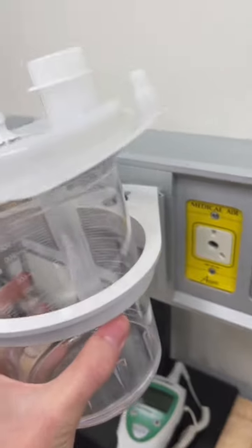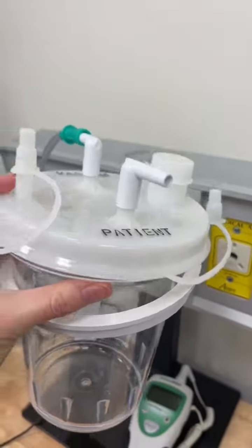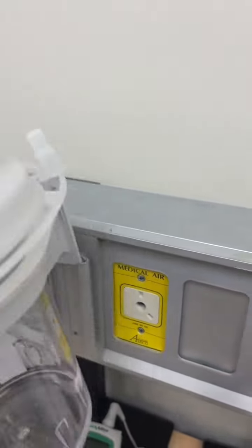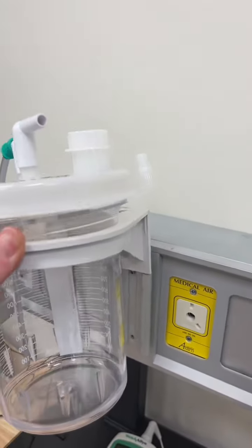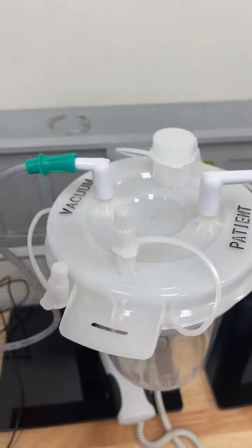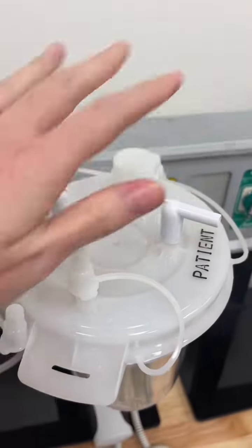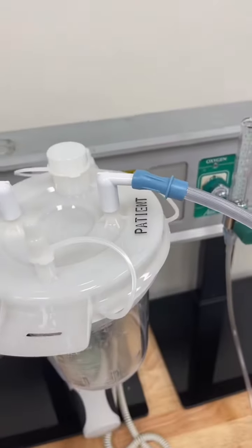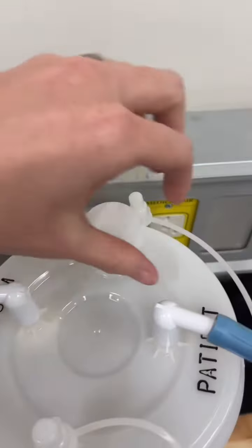The canister just comes out like that, okay? And you can also pull this whole thing off. It just slides back on. But what's important for suction to be maintained is that all of these things are covered or the caps are on. So you will see that I have this hooked up to my patient, this hooked up to the vacuum. This one is covered up.